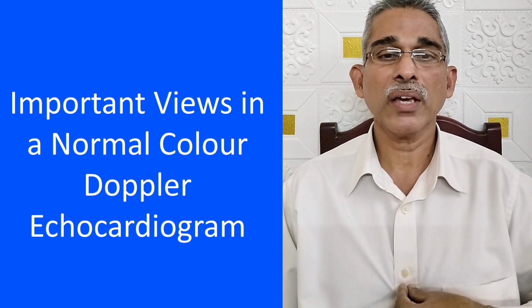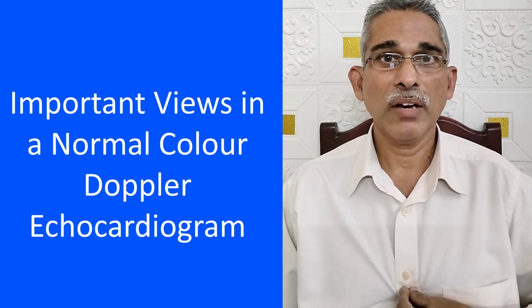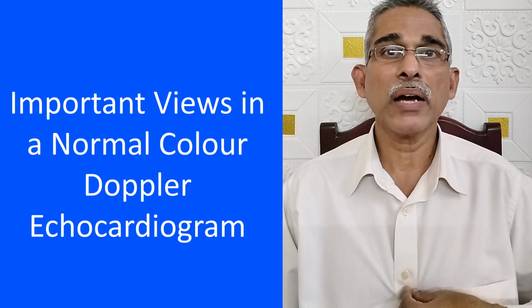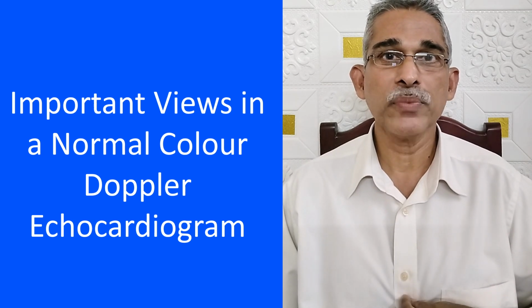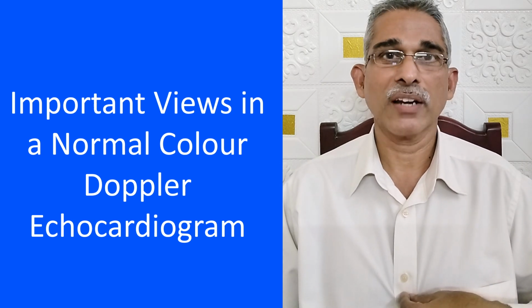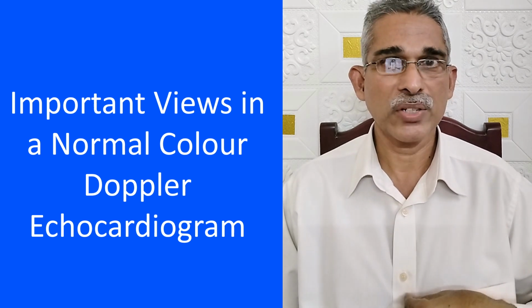Next view is the subcostal view. Subcostal view is very useful in two situations: when there is emphysema and the heart is pushed down, the subcostal view will become much better compared to parasternal views where the lung will overlap the heart in emphysema. So in emphysema, one of the best views will be the subcostal. Another situation where subcostal view is best is in congenital heart disease, pediatric evaluations.